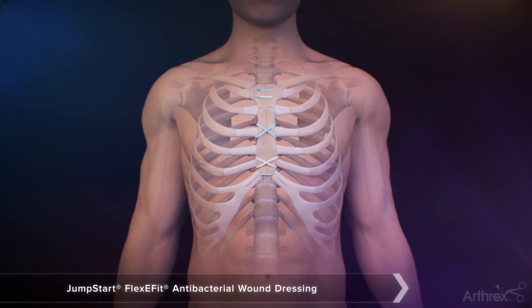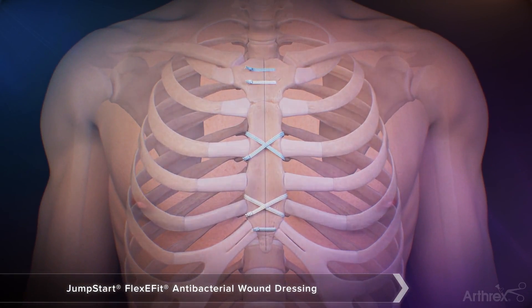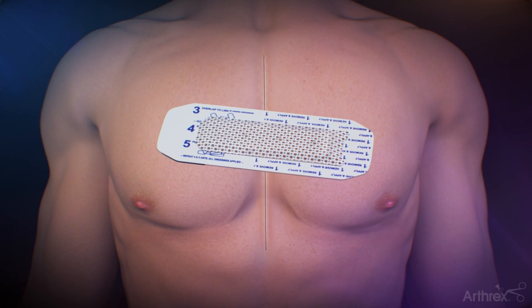For cardiothoracic surgery, the Jumpstart FlexiFit provides the optimal solution for wound covering, as the dressing can be joined together based on the length of the patient's incision. Start by hydrating the FlexiFit dressing with Energel Wound Hydrogel.